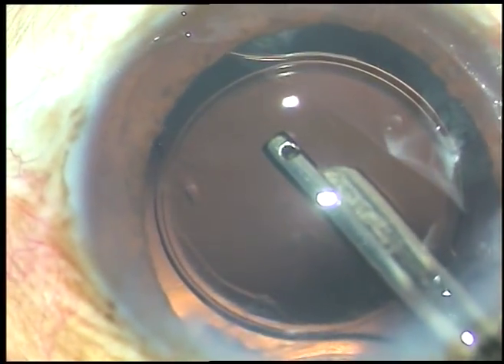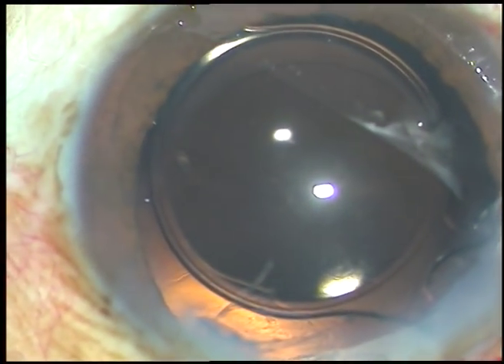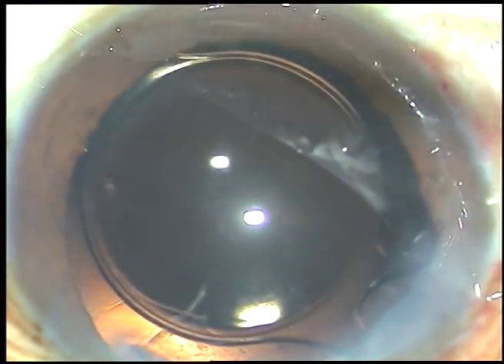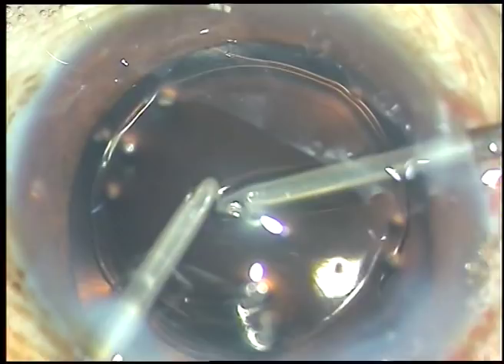Anyway, I have to use vitrectomy cutters. Before that, I am using the bimanual irrigation aspiration for further cleaning of viscoelastic substance.